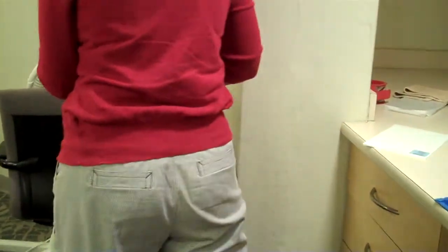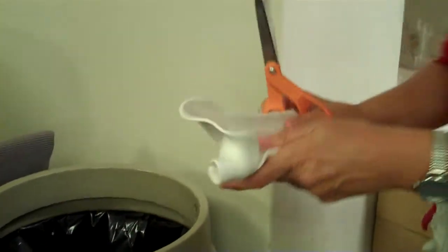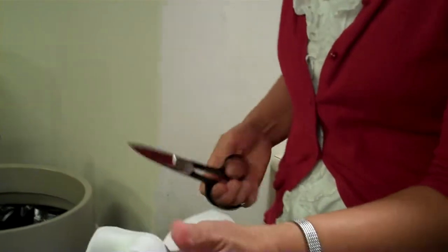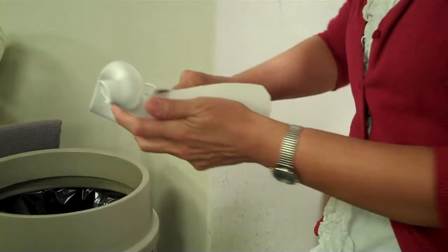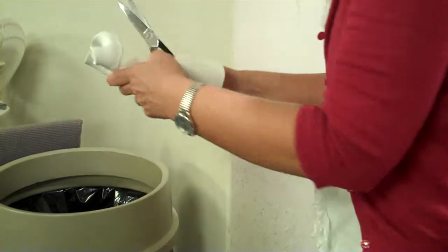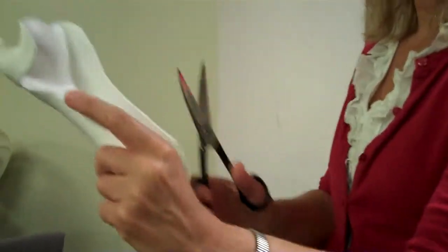So now's the time when it's still kind of soft to start working on those things in the problem areas. Do you want these curved scissors? Yeah, I love those. Thank you. I always say it's better to have too much splint material than not enough, because you can always cut it off, but it's really hard to put back on. And again, that's a nice area that we're going to have to straighten out, that ridge there.